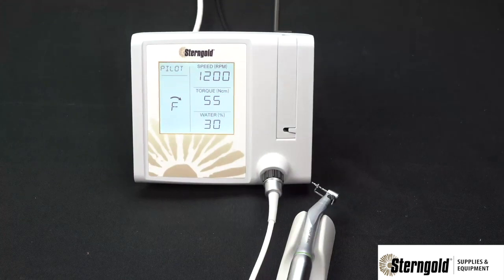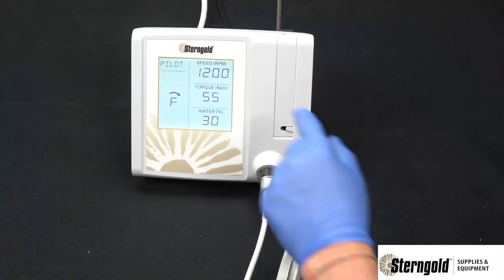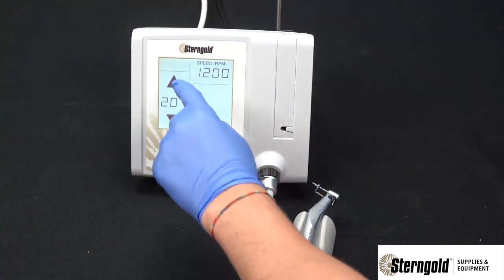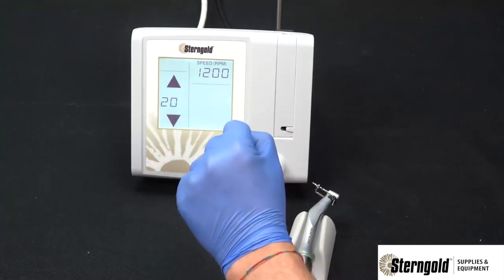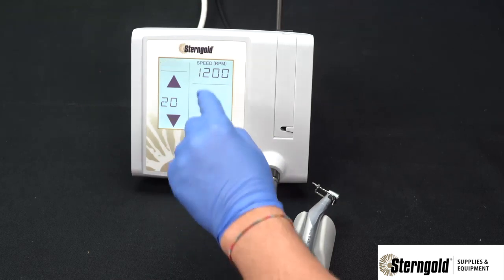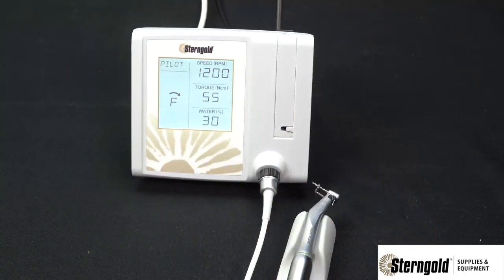Adjusting the unit is very easy using the touchscreen. To adjust the speed, simply press the speed section of the operating screen. Use the up and down arrows to increase or decrease the speed. Once the adjustment is made, press the speed section again to return to the operating screen.